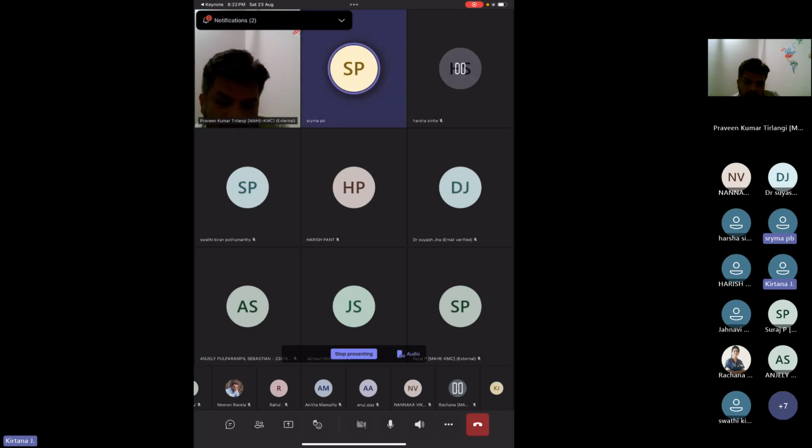Then I have used the recruitment inflation ratio if the patient is paralyzed. But as I said, I use it only to exclude patients in whom I do not want to use a high PEEP, not to set the PEEP as such. And another thing which may be useful is lung ultrasound. There is something called the re-aeration score, in which you can give a higher PEEP and see the lung. So that's also something you can find out.